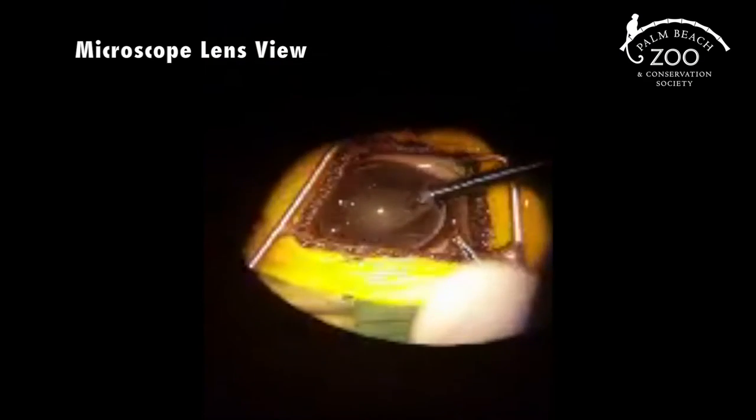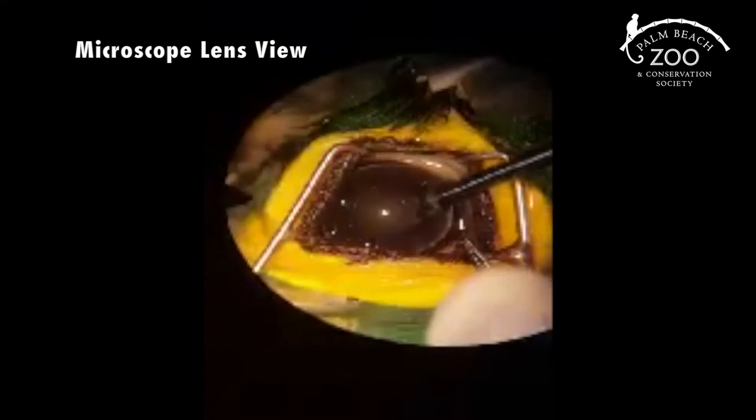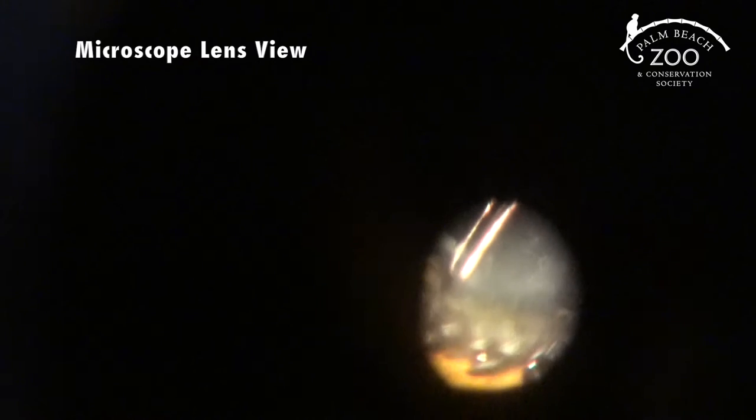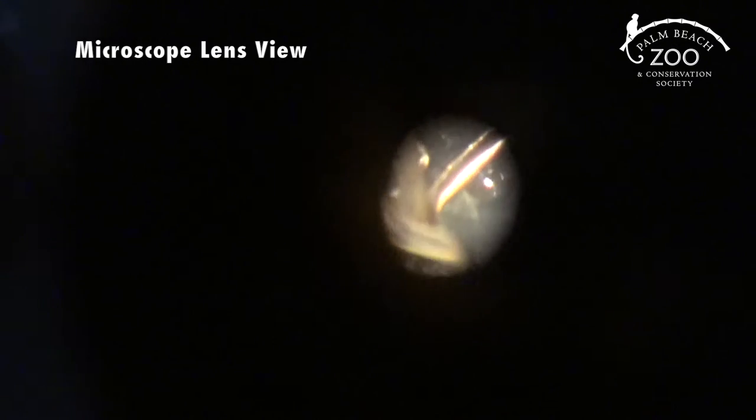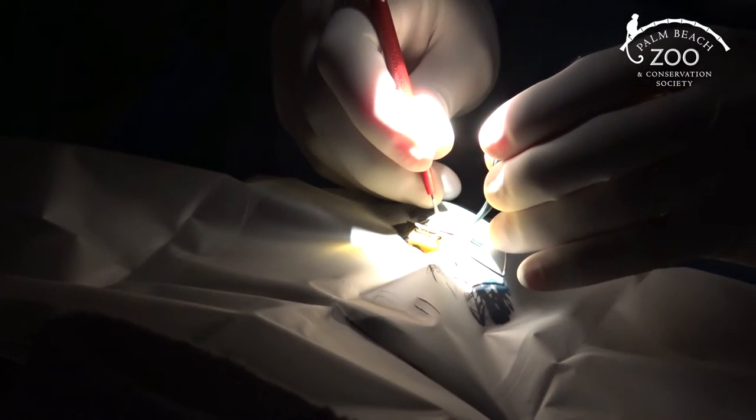This is Dr. Karastro working through her microscope on the cataract — something people will likely never see in their lifetime. She is literally inside, under the cornea, in the eyeball, taking out the very last little pieces of cataract that did not come out with the suction. It's a very delicate procedure, which is why there cannot be any muscle whatsoever flinching, even in the slightest — no movement at all while she works.